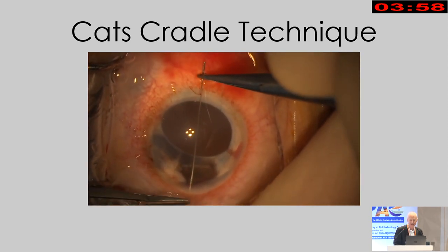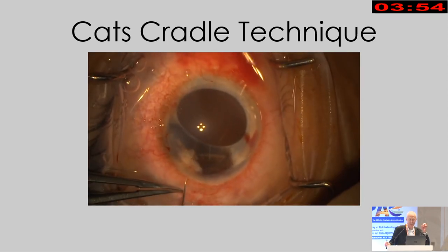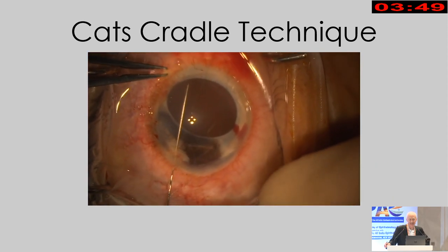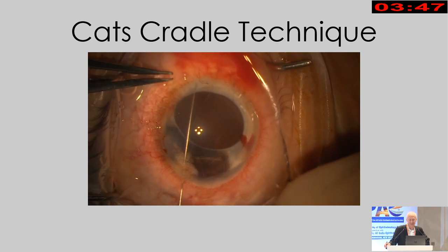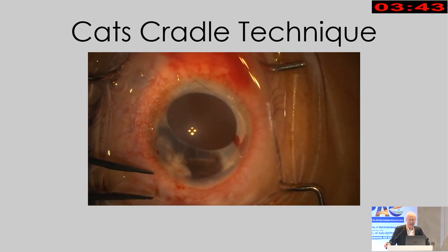We've learned that it's best if you don't make your incisions until after you've done this, just a very small incision to keep filling the chamber through, and leave the other incisions until afterwards. This is very difficult in the soft eye. And so we're going backwards and forwards there across the chamber to create that safety net pattern.